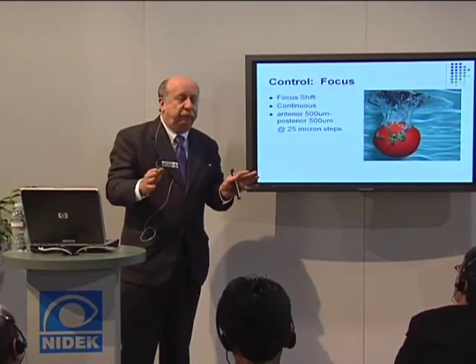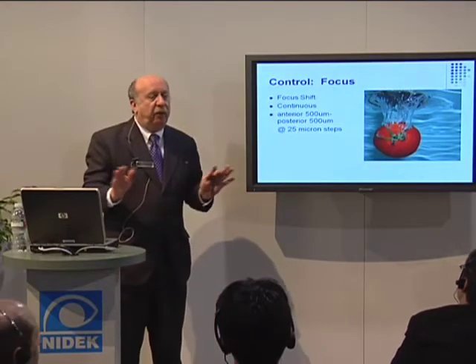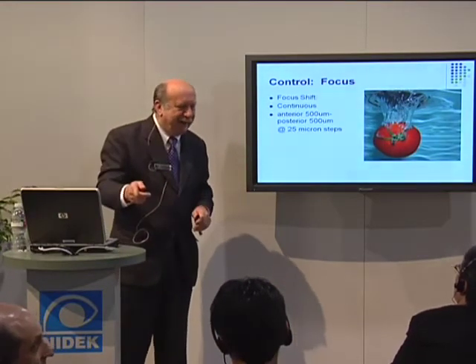Understand, pitting is for PMMA lenses and fogging is for silicone lenses. And the doctors don't want that. That's why they start in the periphery.